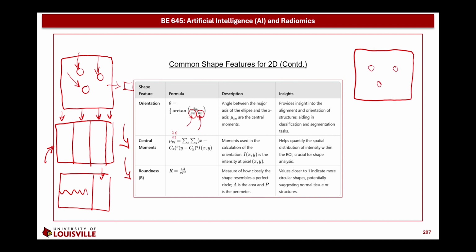Another example, and in that case, we can obtain a dataset that internally got multiple ROIs as mentioned, but each ROI will reflect a specific category or a class. For example, this one is normal, this is benign, and this is malignant. So in a single case or in a single image, we have multiple categories. In that case, we will treat each of them individually. How to do that?